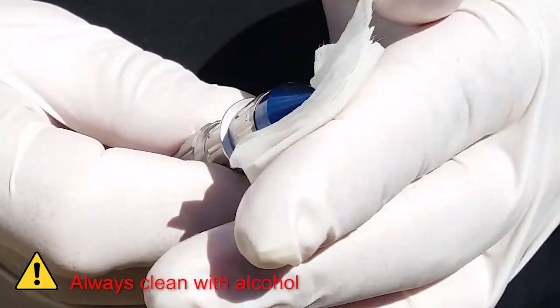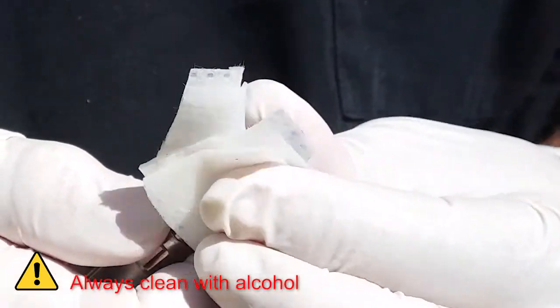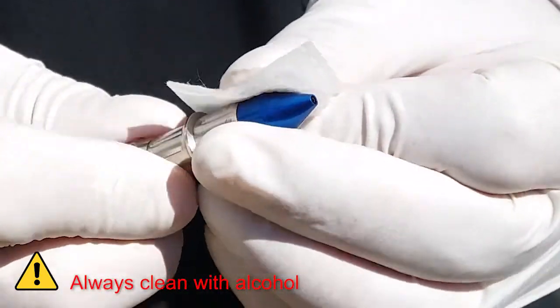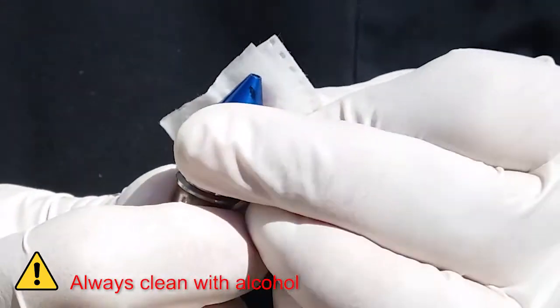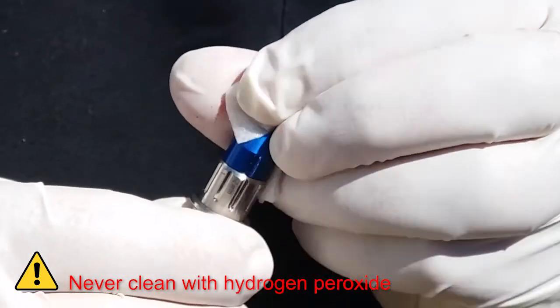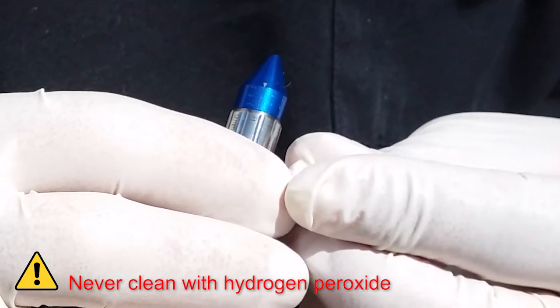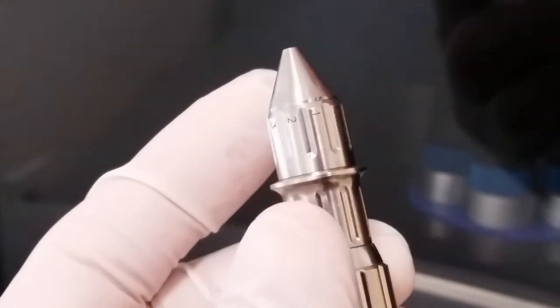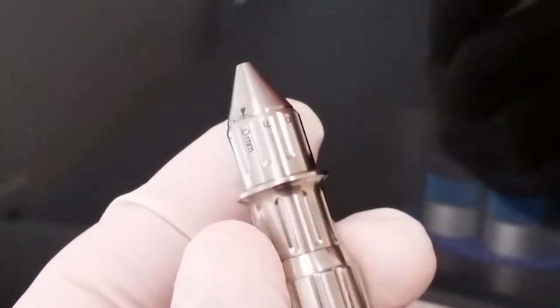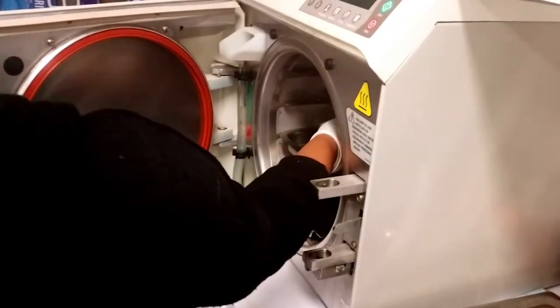The blue depth stop is made of anodized aluminum. For this reason, you should not clean this with anything other than alcohol. Do not use hydrogen peroxide because this can discolor the depth stop. If you have a silver depth stop, this is composed of stainless steel. You can clean this depth stop with any solvent you like, including hydrogen peroxide, and then autoclave it.